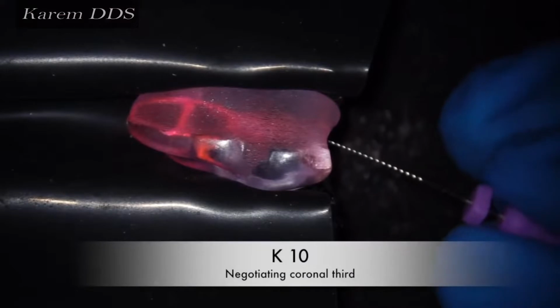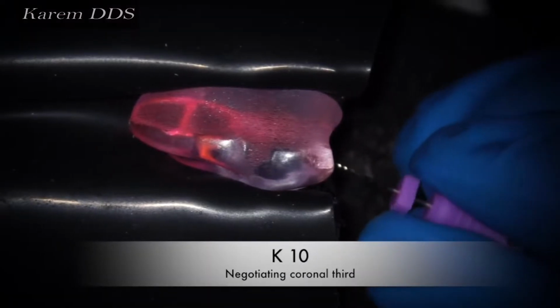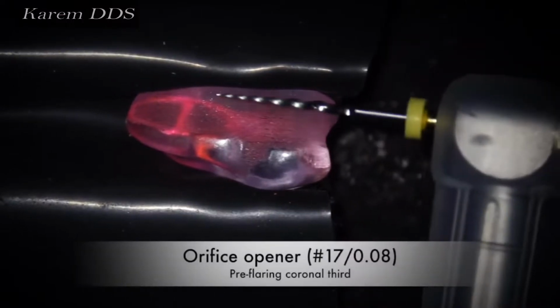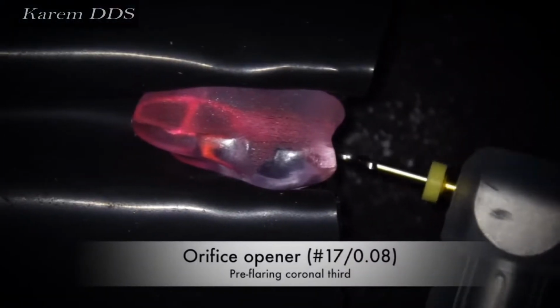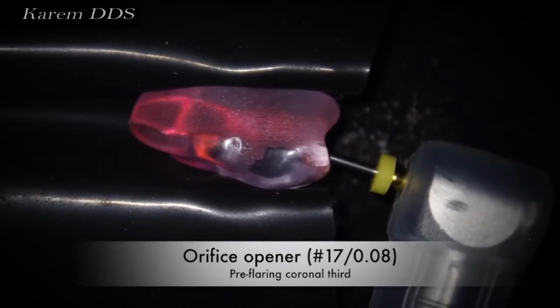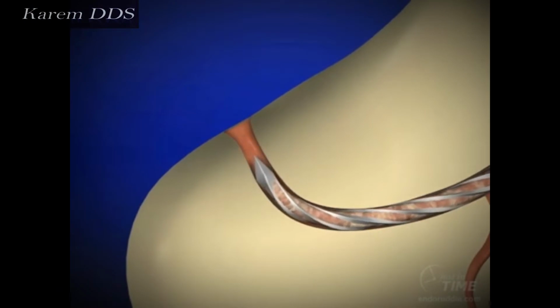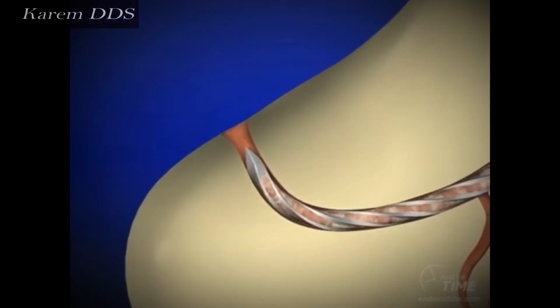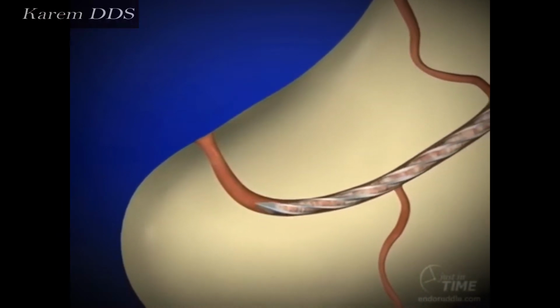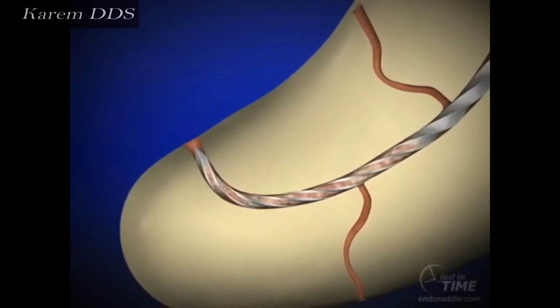In non-surgical endodontics, root canal treatment requires the use of files and instruments to remove necrotic and infected tissues. The steps in this process are to use a hand file to obtain patency in all the root canals of a tooth, to measure the working length of the teeth, and then to use rotary instruments to shape the root canals in preparation for sealing and obturation.